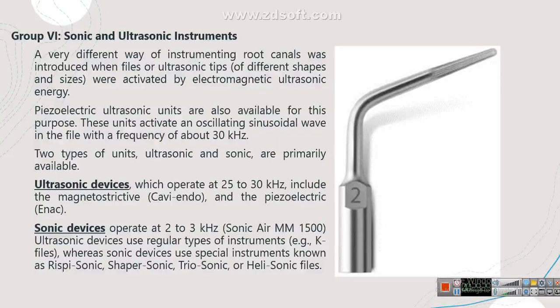A very different way of instrumenting root canals was introduced when files or ultrasonic tips of different shapes and sizes were activated by electromagnetic ultrasonic energy. Piezoelectric ultrasonic units are also available for this purpose. These units activate an oscillating, it means like circulating, sinusoidal wave in the file with a frequency of about 30 kilohertz.